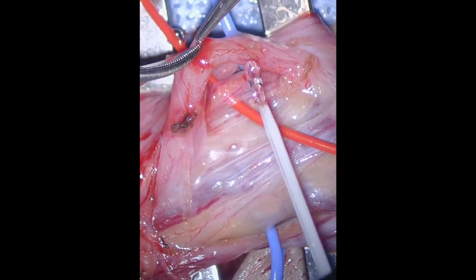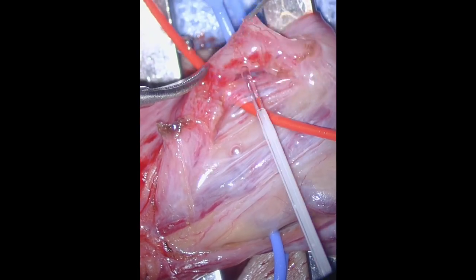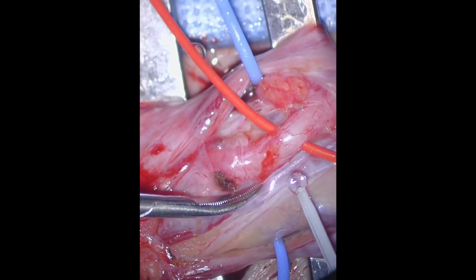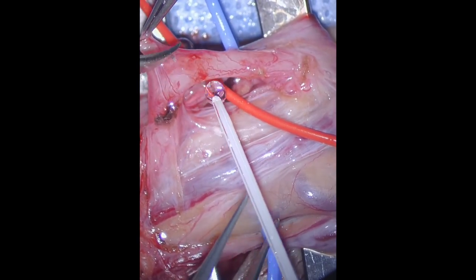Here we present a different case in which vasosparing is performed. The vas in this case is completely stripped of its perivasal tissue for a length of approximately 2 centimeters.